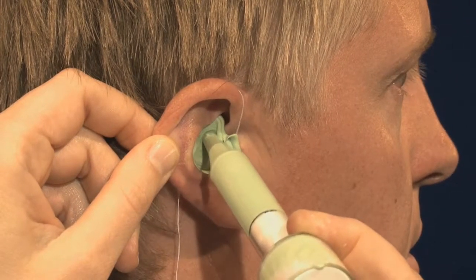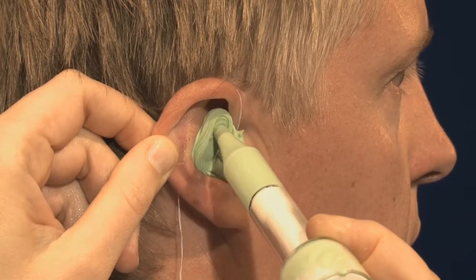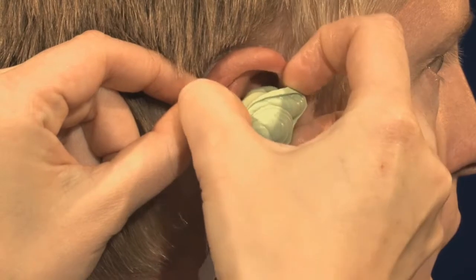The first step in making a properly fitting and comfortable hearing aid shell is still making an accurate impression of the hearing aid user's ear. In the future, it will be possible to directly scan the patient's ear canal and transmit the data electronically.